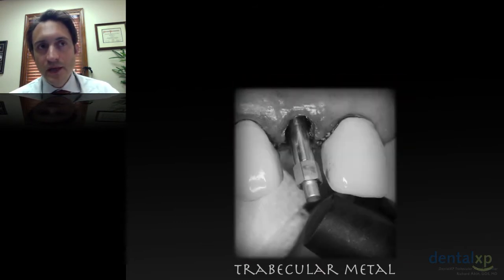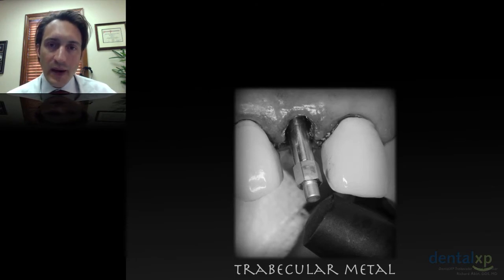And after the implant's placed, typically what I'll do is an Osstell reading. Osstell's been a big part of my practice as well. It helps me with one more determination of implant stability. We have our handpiece, we have how we prepare the site, and we have the torque drivers, which give us that tactile sensitivity. Osstell also helps me with tracking implant healing and provides me a stable baseline. And if I think there's a problem over time, we can take out the temporary and provide an Osstell reading, which is a great device and takes out the guesswork.